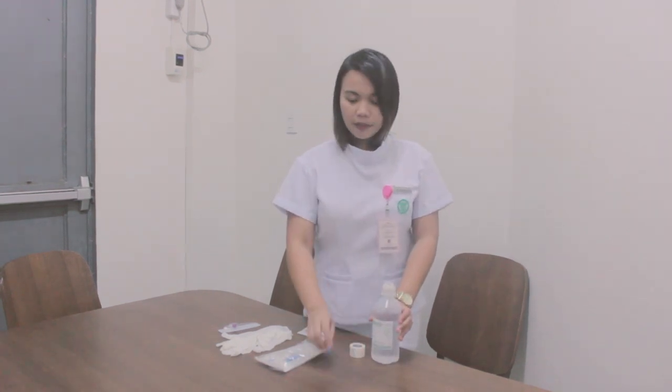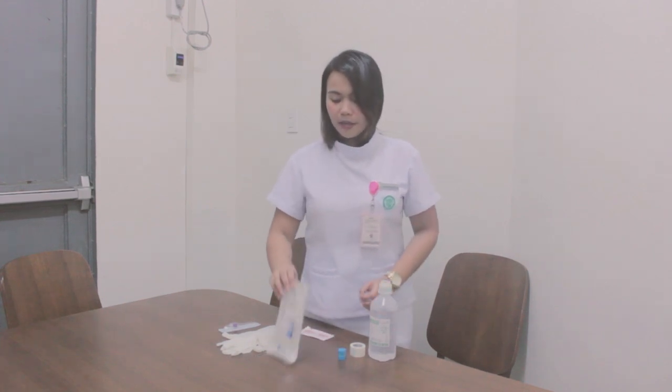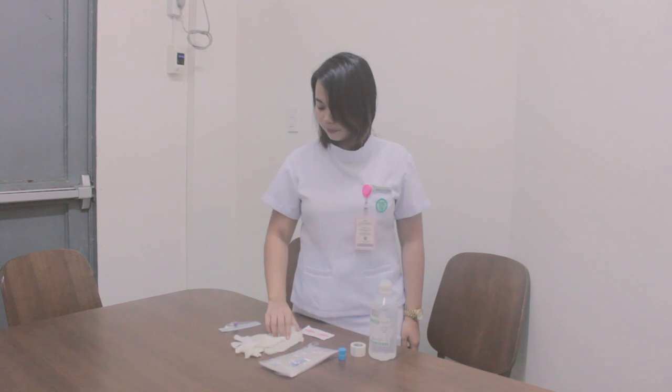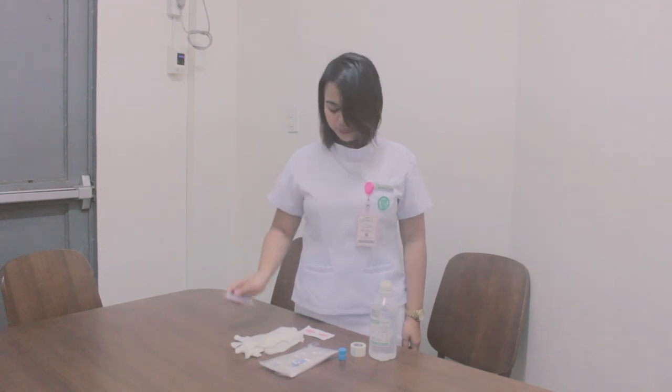So these are the materials that we'll be needing for the IV insertion. First, 500 ml of NSS, micropore, tourniquet, the IV tube, sterile hand gloves, the cannula, and then the alcohol pads.